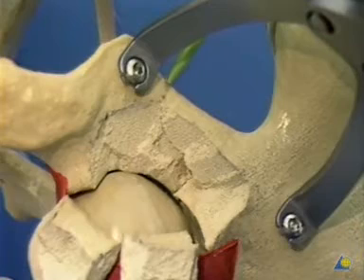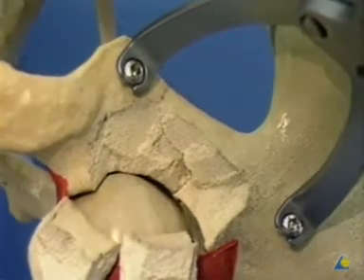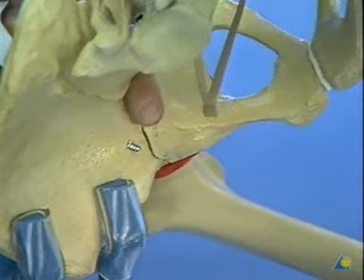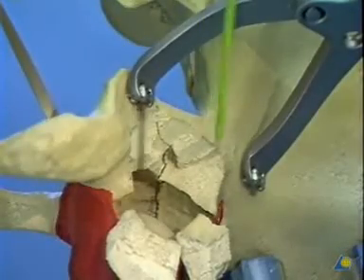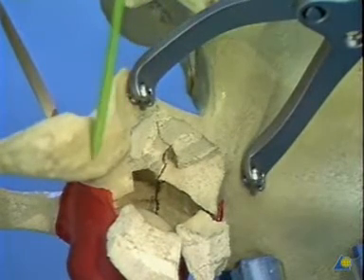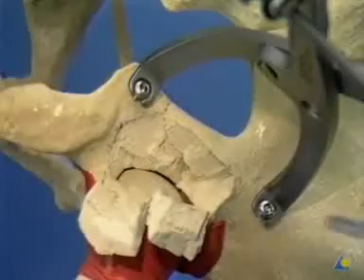The reduction appears perfect as visualized at the greater sciatic notch and the retroacetabular surface. Palpation through the greater sciatic notch, however, reveals a step along the quadrilateral surface and pelvic brim. Distraction of the femoral head from the joint also reveals a step in the articular surface. This malreduction of the acetabulum is due to rotation of the lower ischiopubic segment.